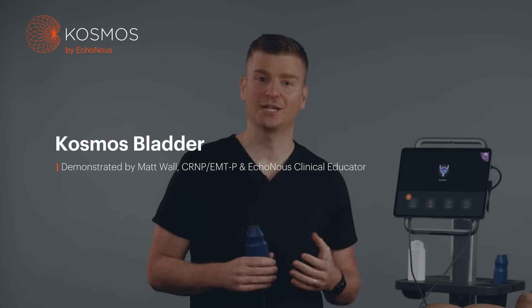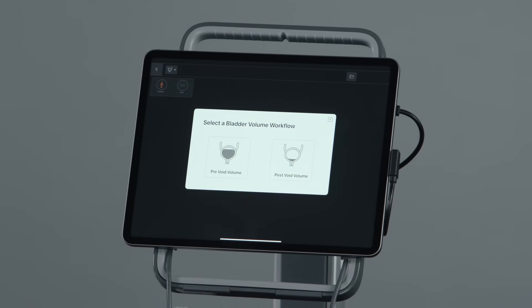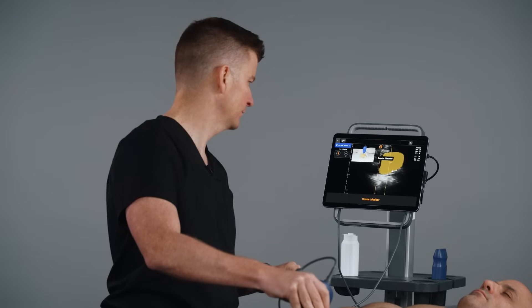Hi, my name is Matt. I'm a nurse practitioner and clinical educator here at Ekinos. Today I'm going to walk through how to use Cosmos Bladder. Using state-of-the-art AI automation, Cosmos Bladder is a new generation of bladder scanner, making bladder volume calculation easier and more accurate.